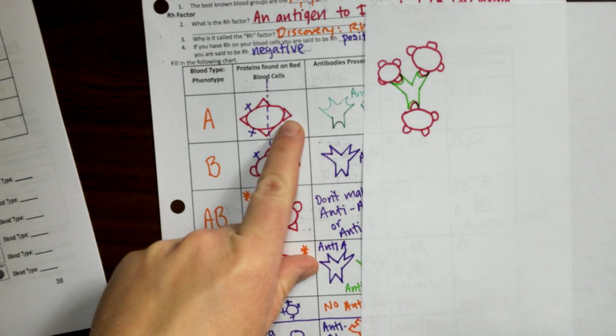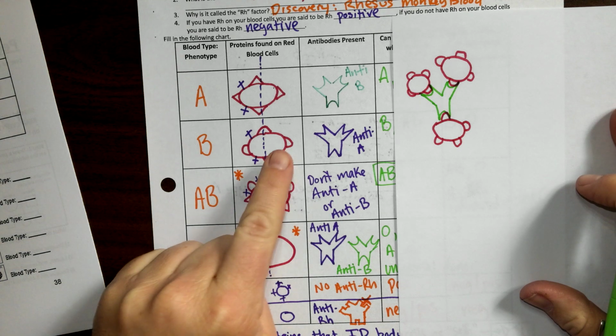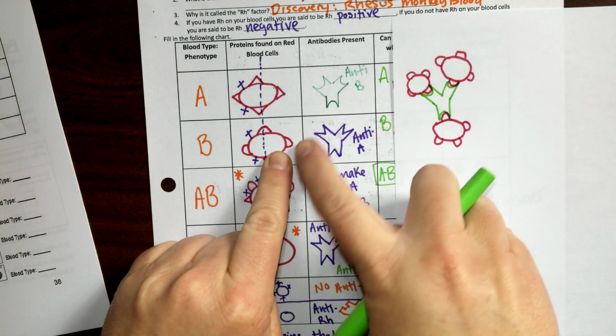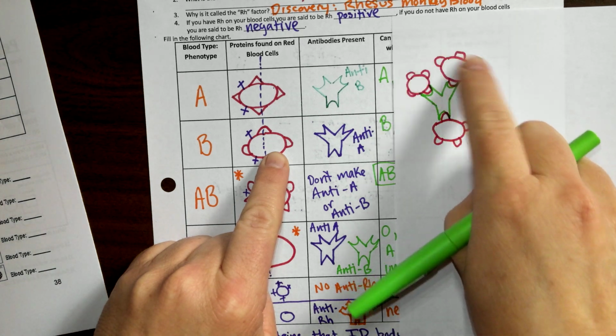and if it does, then we know that we've identified that a certain blood type contains a certain shape. For example, if we were to take type B blood and add anti-B to it, then a whole bunch of the B would all clump together like this.